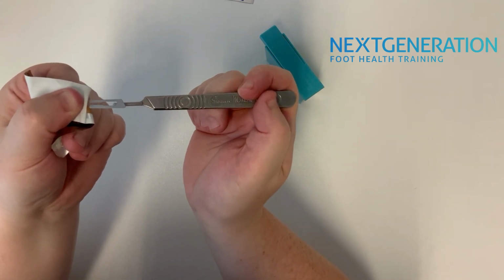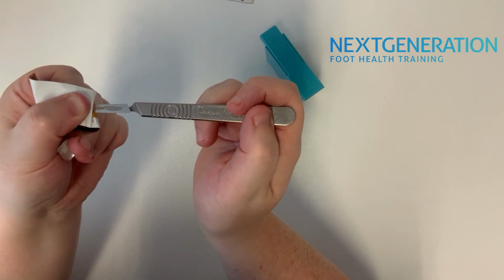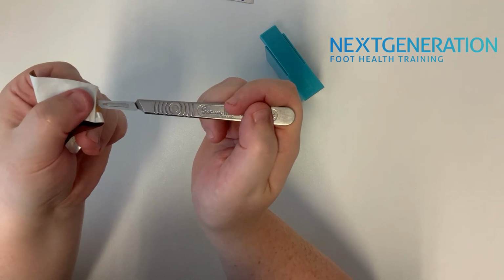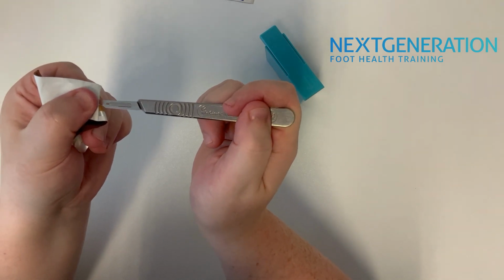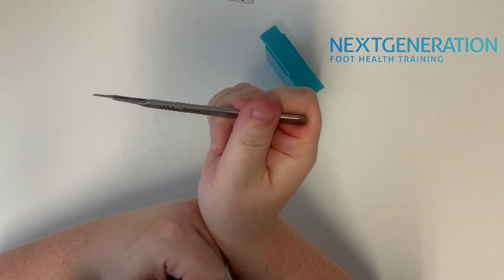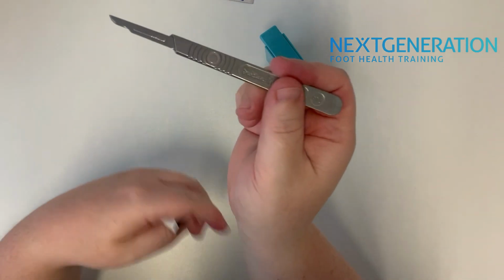So we're going from underneath through the big hole, then we're bringing up the handle piece level with the blade, attaching the grooves around the tip onto the actual blade itself. Just a little gentle encouragement, and you might just hear a click. There we go, and that is securely now on your handle piece, your blade, sorry.